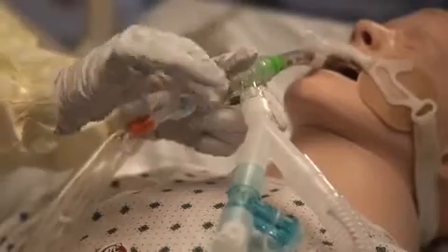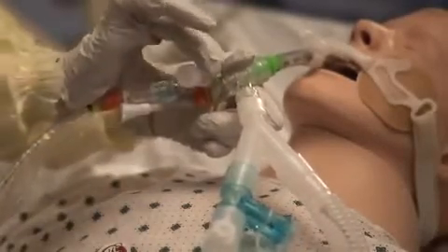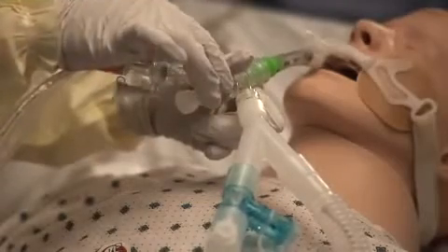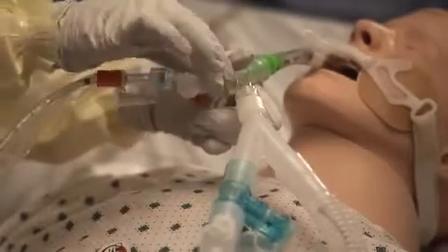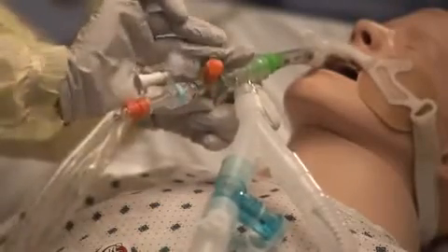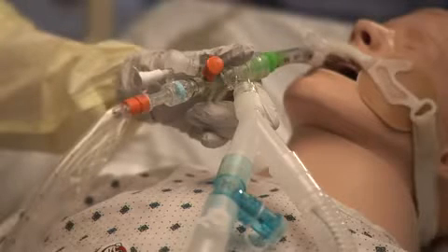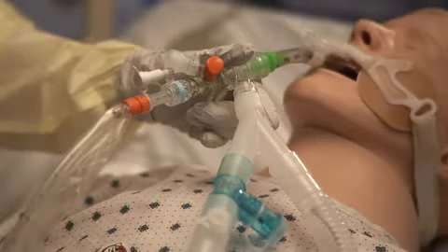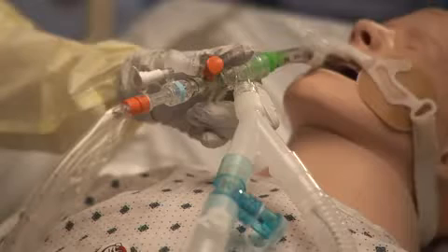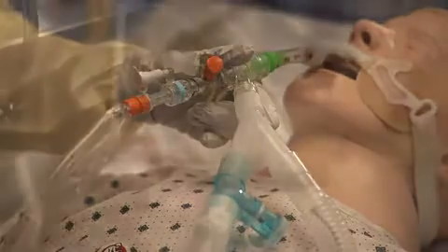But with KimVent Multi-Access Port Closed Suction System, the compact rotating manifold provides multiple ports to access the patient's airway, locking into place with a click. This reassures that the circuit remains sealed, enabling catheter replacement without opening the circuit. The single-use seal cassette maintains PEEP during insertion of a sampling catheter or other devices, so both suctioning and alternate procedures can be performed while maintaining a closed vent circuit.